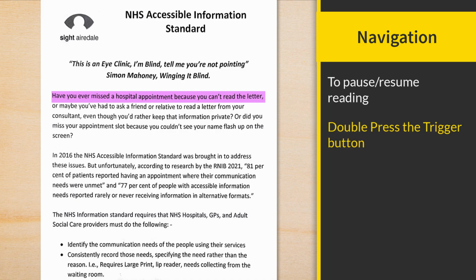So now if I want to pause this, all I have to do is double press the trigger button. And that will pause it. Now to resume from where I left off, I just double press the trigger button again.